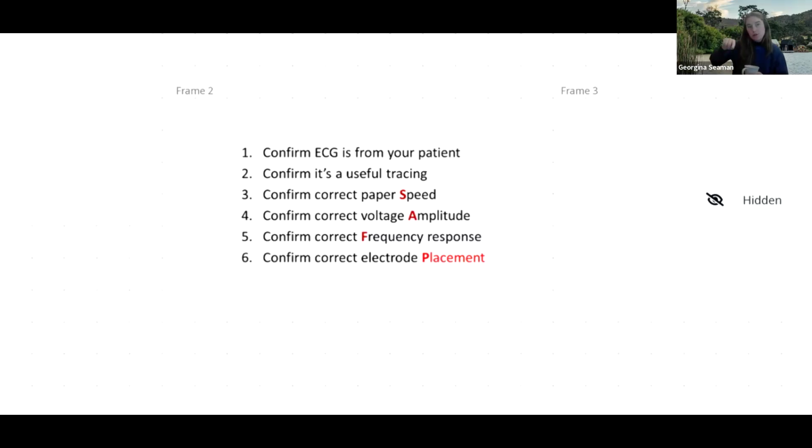So it should be 2 boxes, but why would we potentially try and make it larger? So Gareth suggested maybe for different electrode placements. Kate suggested to identify more details. Zoe, maybe an obese patient. All right, so we're getting to some good answers here. Visualize something better. Yes, Chloe, if we can't read the different leads, there's not much electrical activity deflection.